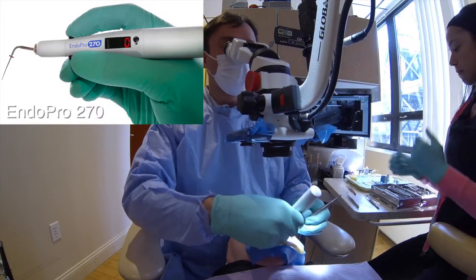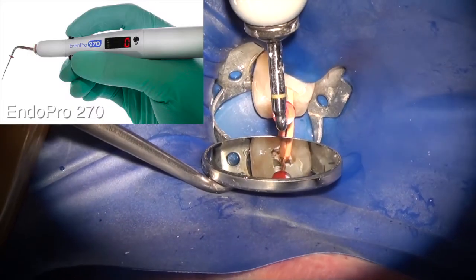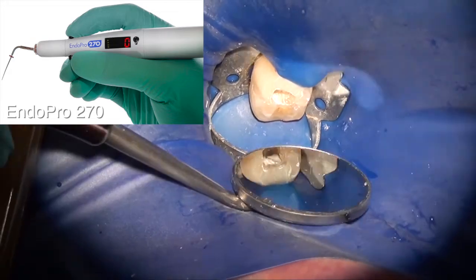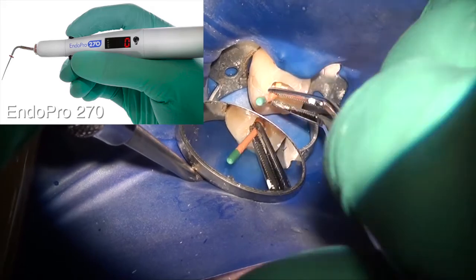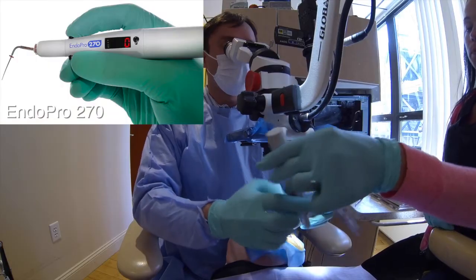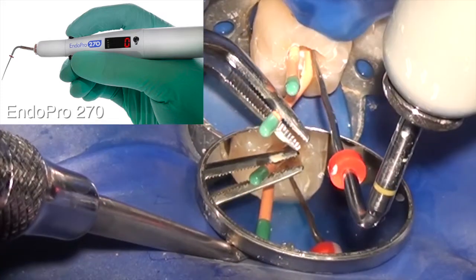Now I'm putting the cones in there. I decided to put one additional cone next to the main 35 that I put on the distal, just because there was an oval shaped canal, there was room, and I wanted to fill it in with another gutta-percha cone. Then I'm seating the other cones that I had fitted as well.